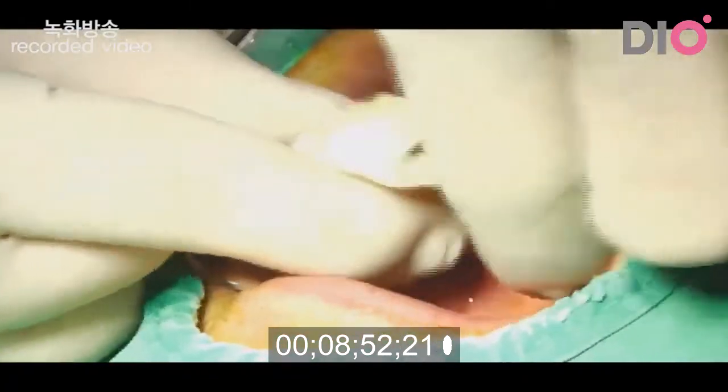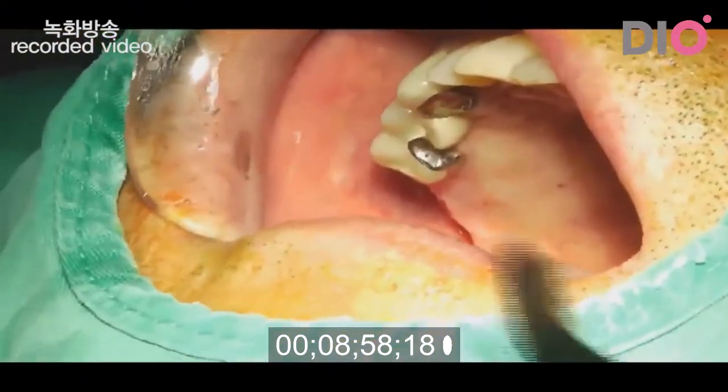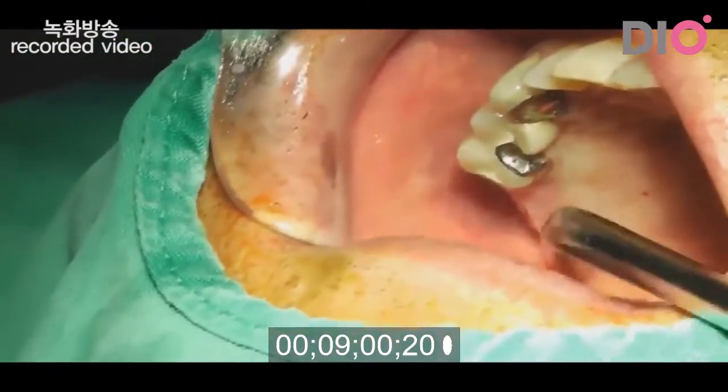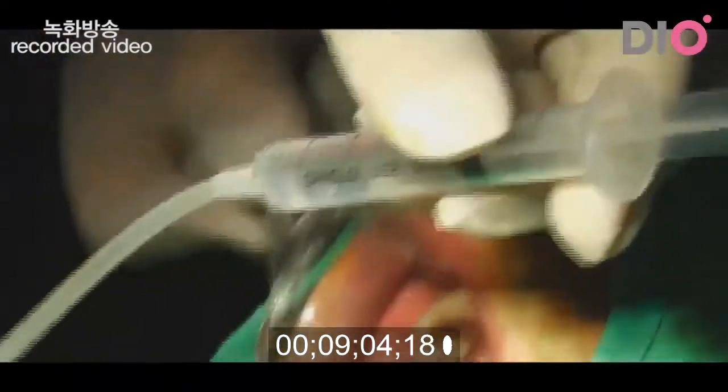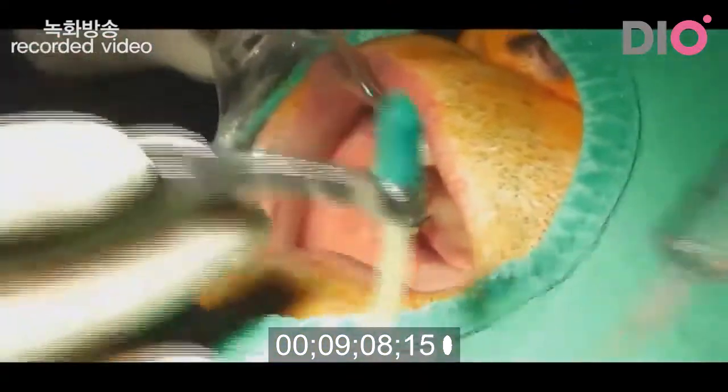Then I will take out the surgical guide. I will remove the surgical guide. And then you can see here the opening site into the sinus cavity. This is the injection syringe and the nozzle. I will use this one.